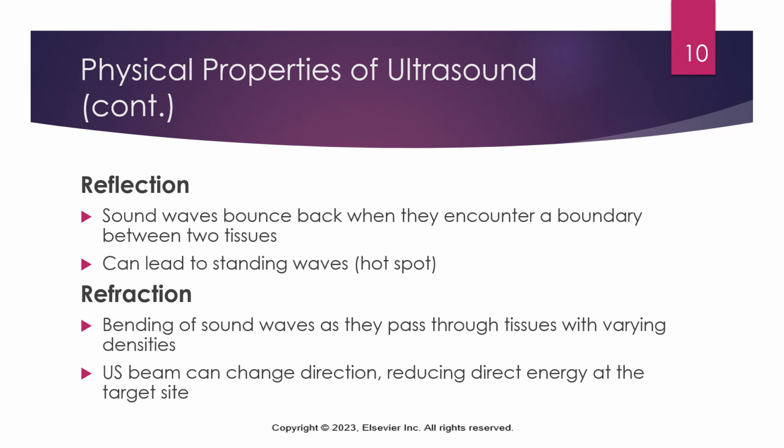So again, some key takeaways from this slide: as with reflection, you always want to make sure that you're moving the ultrasound transducer to prevent those standing waves. We don't want to create hot spots in the tissue, which would potentially burn the tissue and lead to tissue damage. And we just have to understand that energy may not always go straight to the target due to this refraction. So proper positioning and technique are all essential for effective treatment.